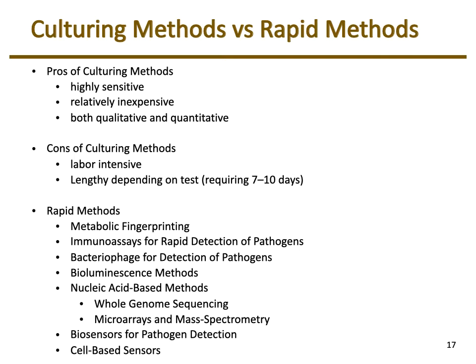And again, as I mentioned, a lot of the additional training that's required for culturing methods is not required for these rapid methods because they're high throughput machines. Some of these have actually been robot made, so that robots are capable of doing it. So then that's where the scientists come in on the technical and the oversight, just making sure the equipment is running correctly.